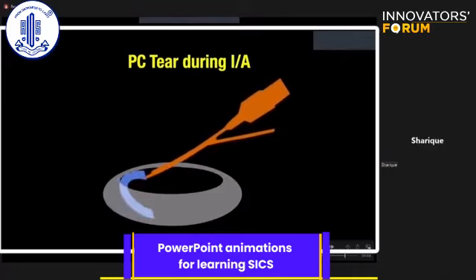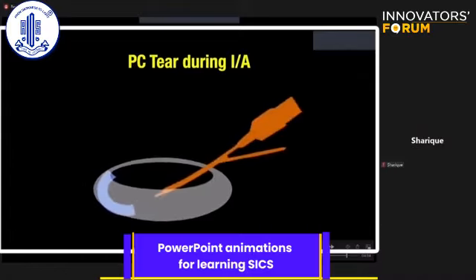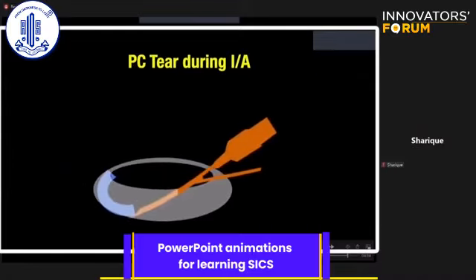If we try to catch the posterior part to remove the cortex, it can lead to inadvertent PC touch and PC tear.